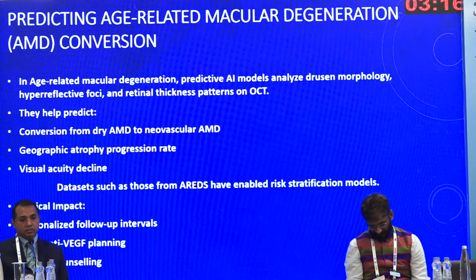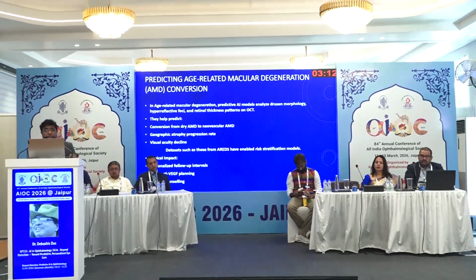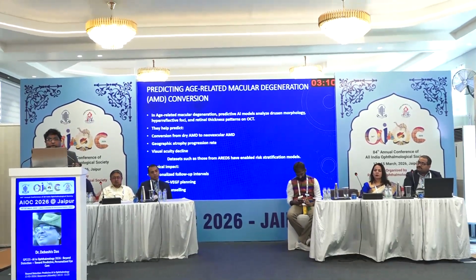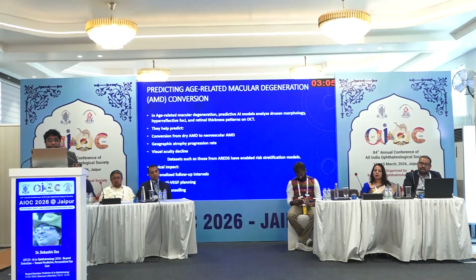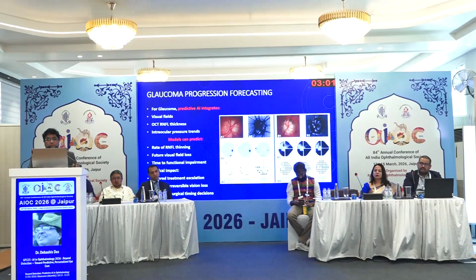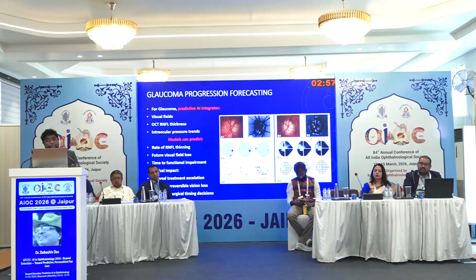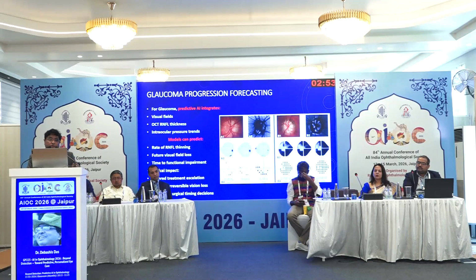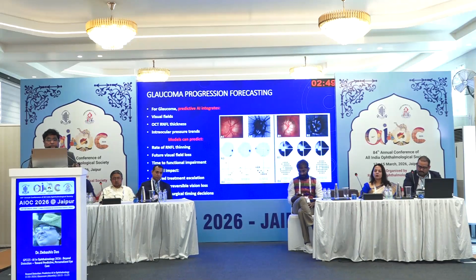And what is the clinical impact? We develop personalized follow-up intervals. Everybody will not need to follow up at a fixed interval. Early anti-VEGF planning to prevent complications, and patient counseling, of course. Coming to glaucoma progression forecasting, predictive intelligence integrates visual fields, OCT RNFL thickness, as well as intraocular pressure trends.